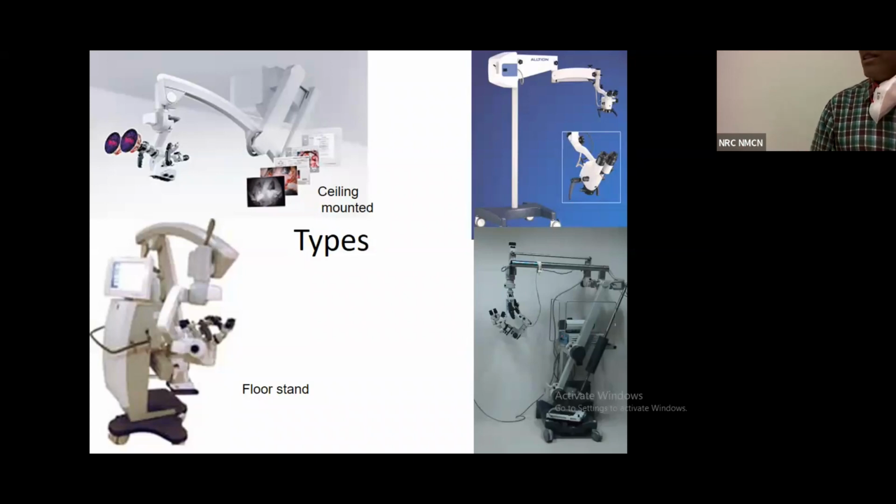The second problem with this is, whenever you are using this microscope, say for instance you have a lead which has to be connected to a TV screen so that the observers who are present in the OT can see the surgery. The lead has to be plugged in and plugged out every time you use a microscope. These microscopes are very delicate things, and even if a single pin breaks, then the entire output function becomes disabled.